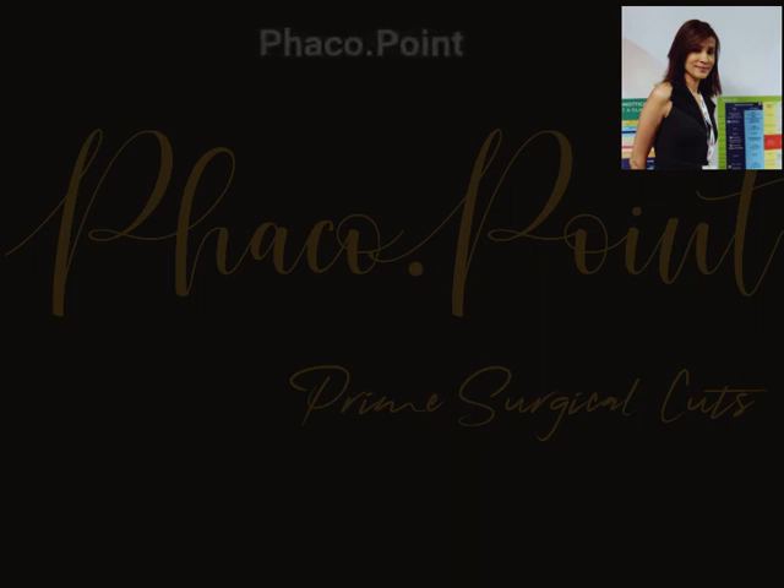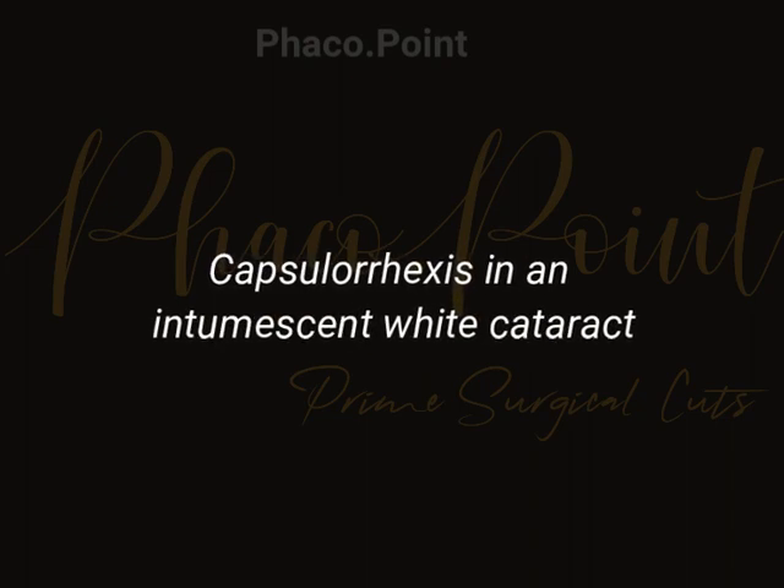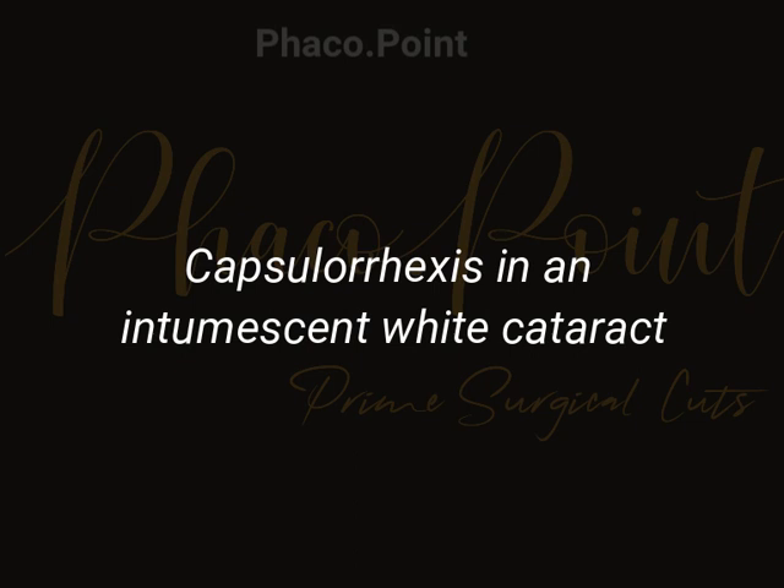In this case, I'd like to demonstrate how you do a safe capsular rhexis in a patient with an intumescent cataract. First, obviously, you need good visibility of the anterior capsule, so it's important that you stain the capsule really well. Take a little extra time to let the blue dye actually uniformly stain the anterior capsule.